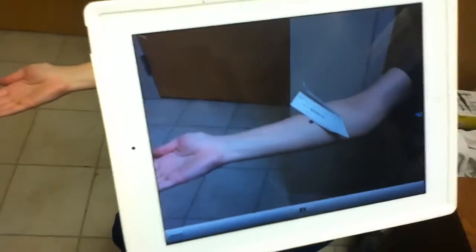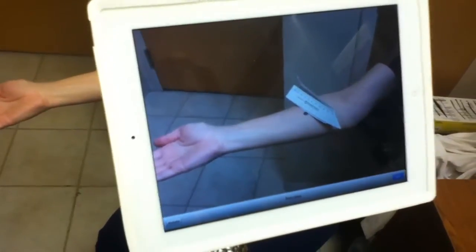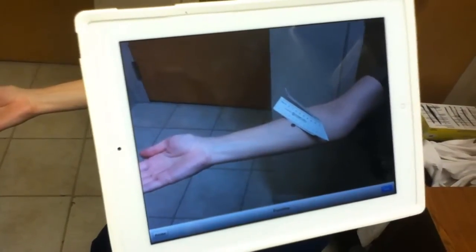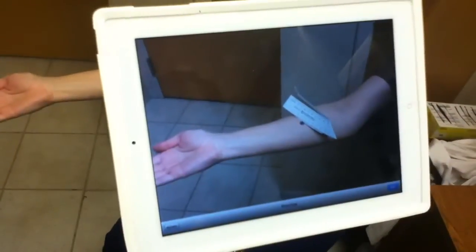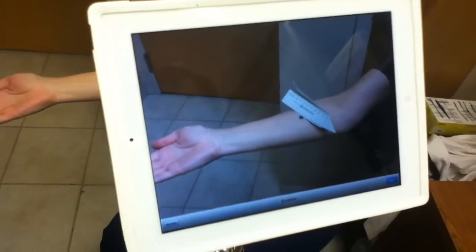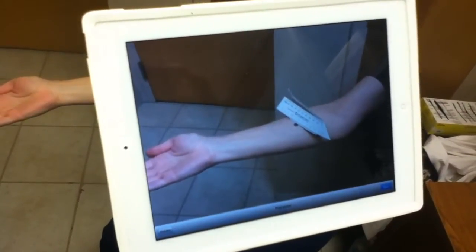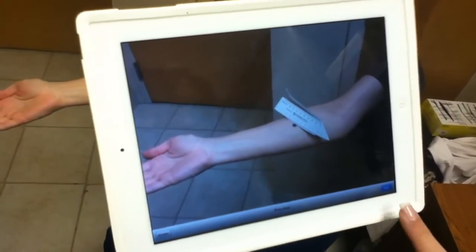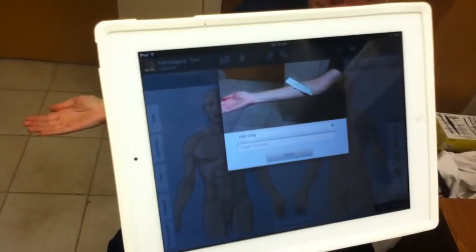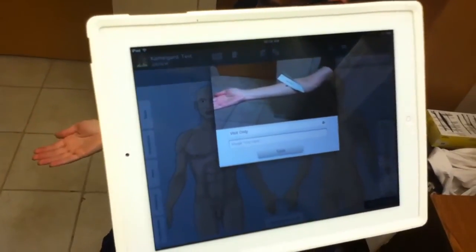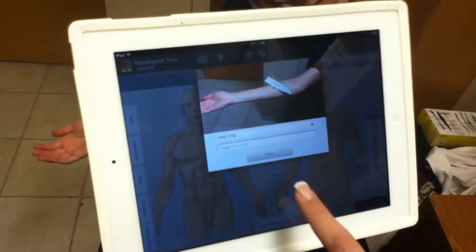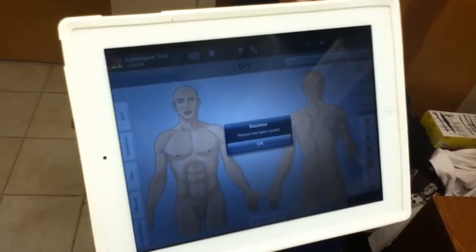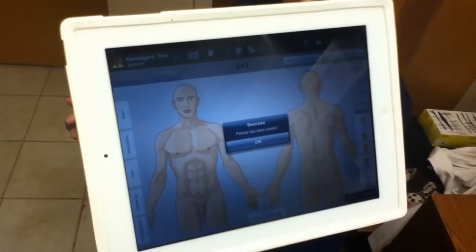Now to take the picture, Caitlin is going to hit the camera button at the bottom of the screen. Shutter snapped. On the left-hand side of the picture is a retake button if you don't like the way the picture looks. On the right-hand side is a use button, so if we're happy with the way the picture came out, we'll hit the use button. This screen gives you a chance to put a title on the image if you want; otherwise it'll just save it by the date. There's feedback that lets you know that the picture was saved.